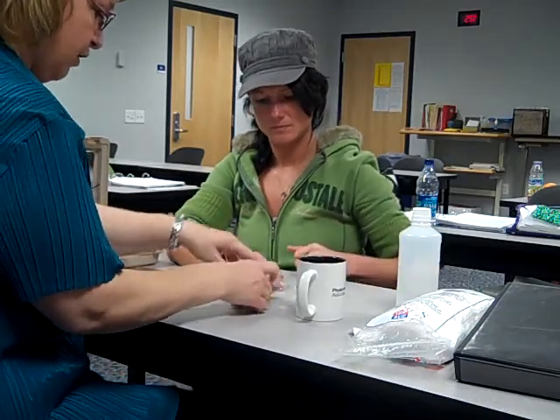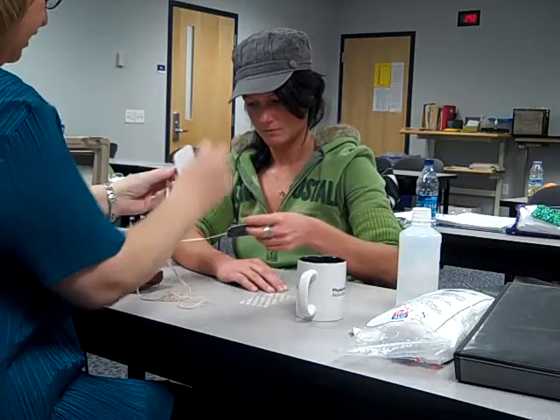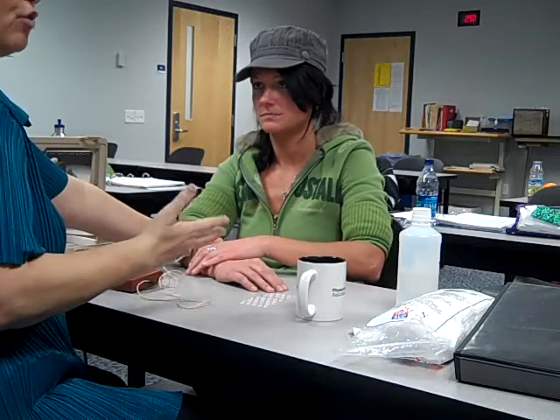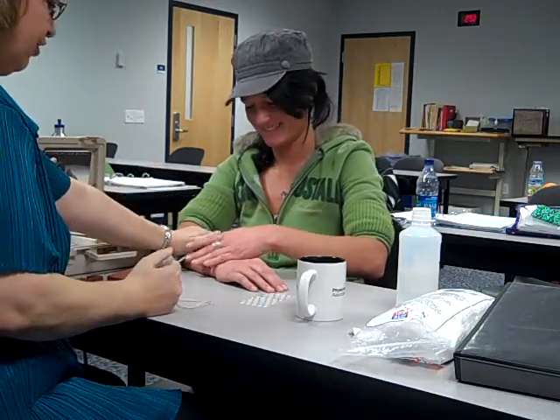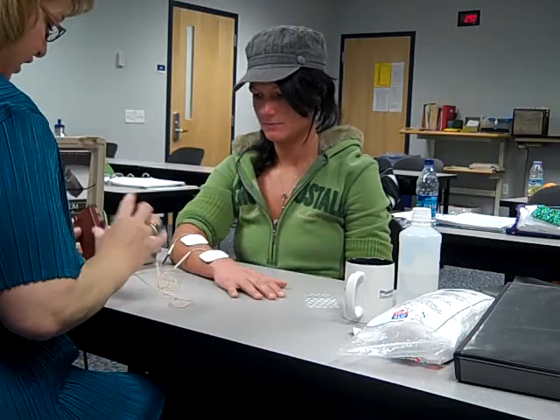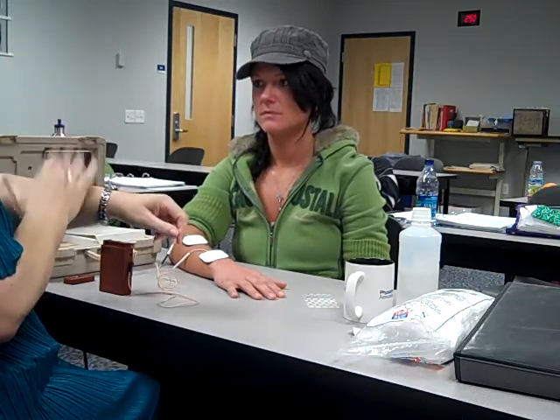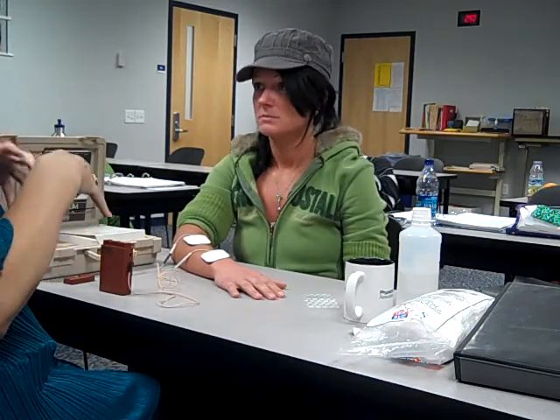Let's go ahead and put these on your arm here — you do one, I'll do one. It's still pretty sticky. Being low rate TENS, it's kind of cool because you can actually see the stimulation. Remember I talked about the twitch? So you're going to be able to see something going on here. I'm going to start turning it up. With this one, patient, what you're going to feel instead of the buzz feeling from the last one is a tapping feeling. What's the explanation for this one? Endorphins — the endorphins are going to be released. The endorphins are like your body's own morphine, so it's going to help control some of the pain. Almost like taking medicine, but it's your body's own medicine within itself.